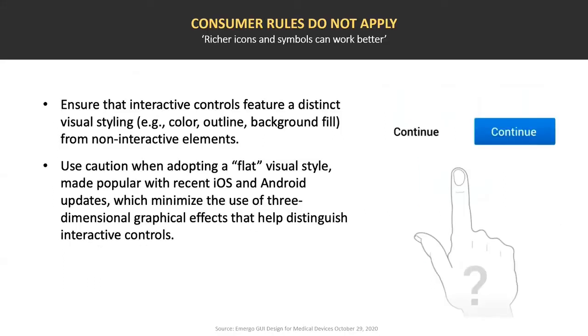Counterintuitively, consumer rules don't apply in terms of graphical user interface. So Tim, you and I a few weeks ago were talking about skeuomorphic design and what that means. It usually comes out on top in user testing when you do it in a medical environment, because skeuomorphic design adds more context, a richness that is not available with flat design, which is the current state of play with things like the Apple operating system and Android systems. So in this environment, it can actually work better.